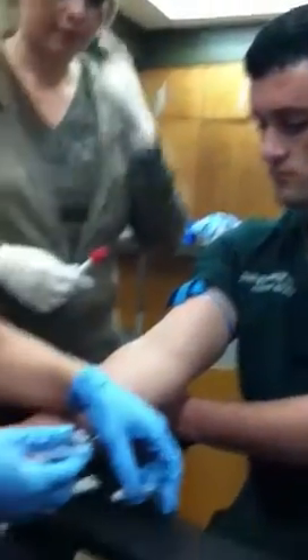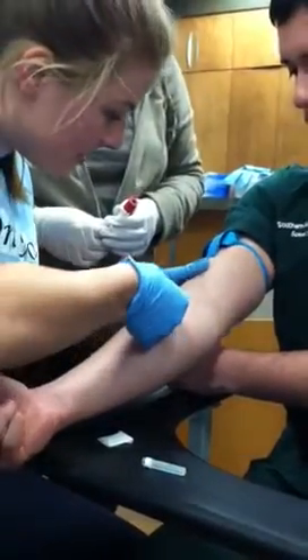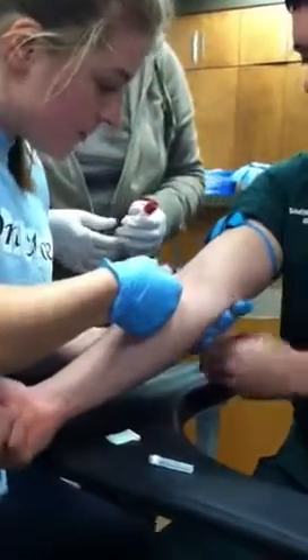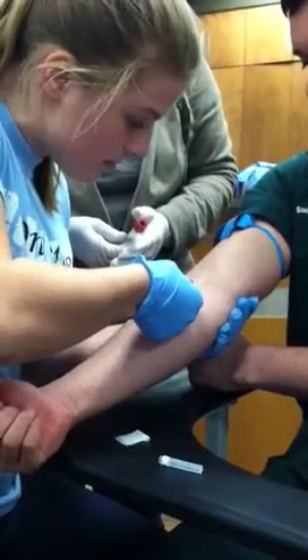Bevel up. Pull the skin a little bit — there you go. Not too tight because you'll obliterate the vein, but you can pull it slightly.